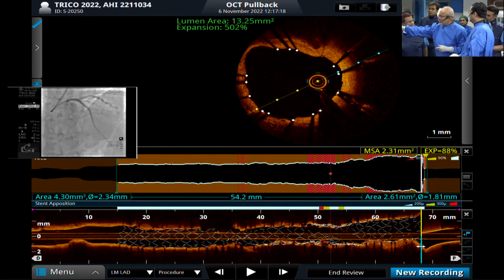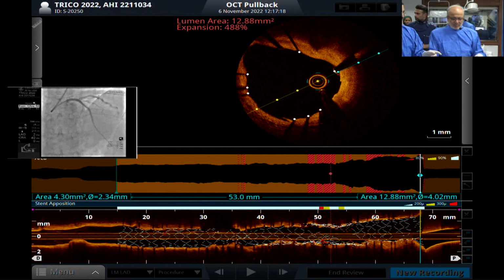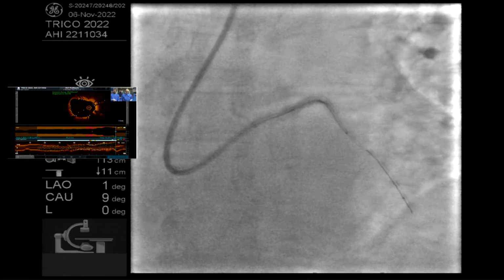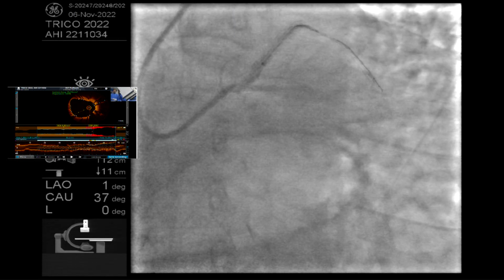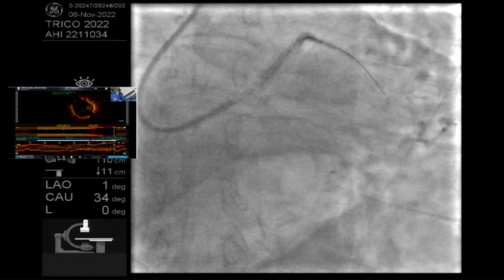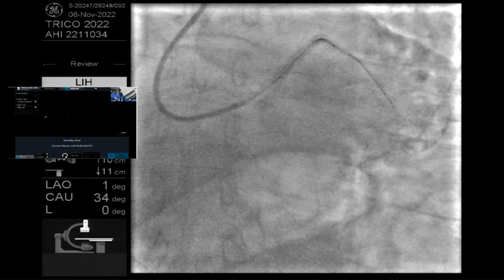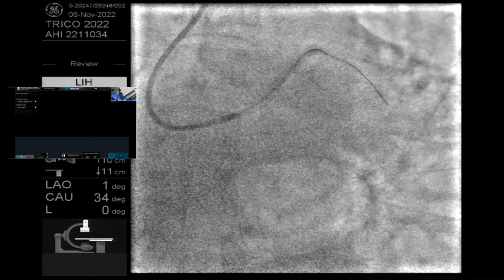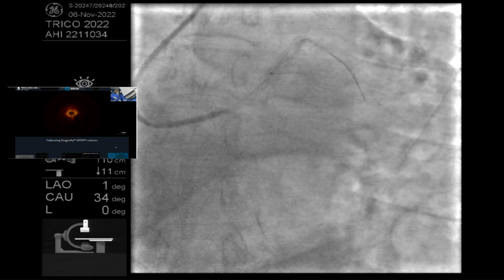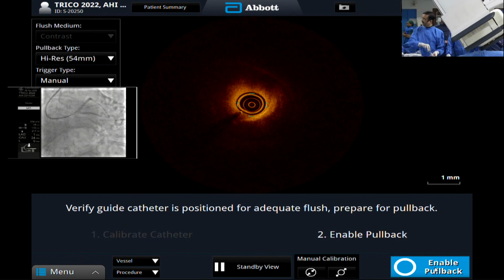Is it ready? This is okay, no problem. Place it at the ostium. Go to caudal. Let me see if I cover the ostium. Scout. Little back. I am keeping it at the ostium now. Scout. Still a little back. Scout. Okay, now take one view. Let me pull it back. Now just see, where is it? Okay, now it will come. Let us see the proximal part again.